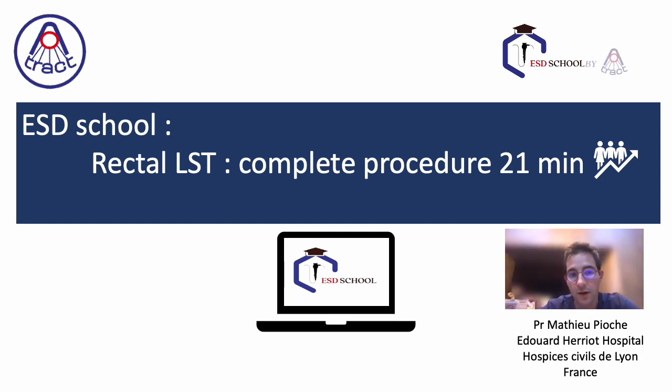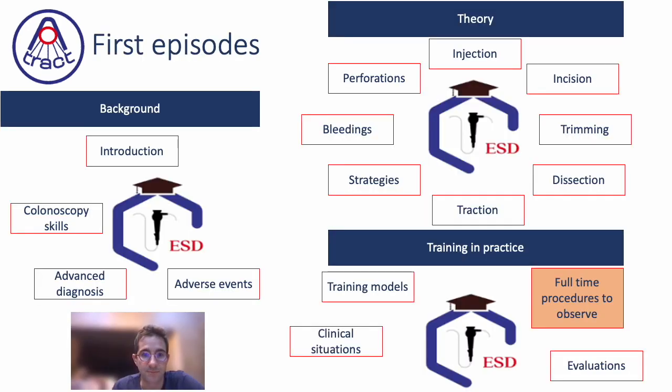It could be a tool you can use as an observation tool, like if you had the chance to be with an expert to see a complete procedure. We chose a short one. Fortunately, you will not have to spend 2 hours seeing this procedure, but in 21 minutes you will see all the steps of the procedure, and I hope you will have an overview of the whole ESD procedure.